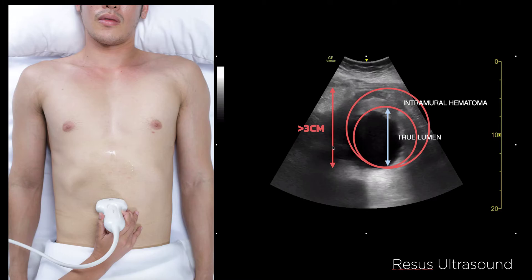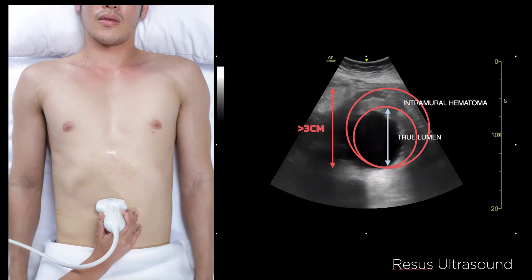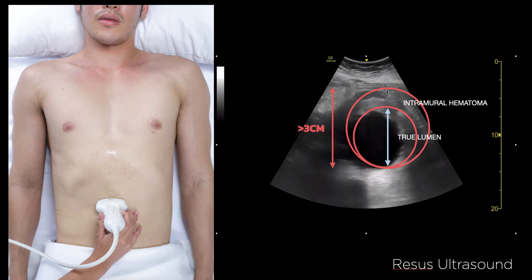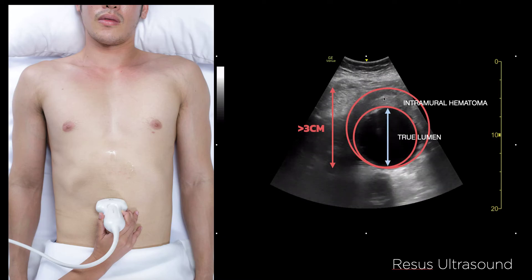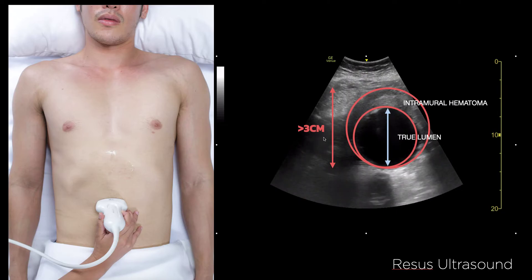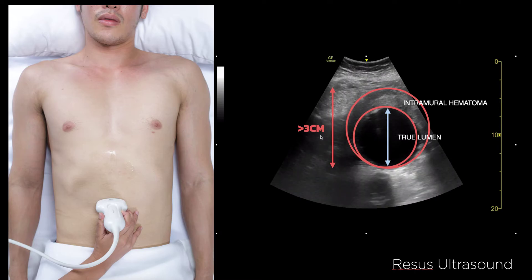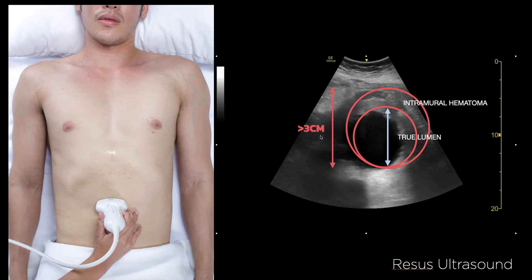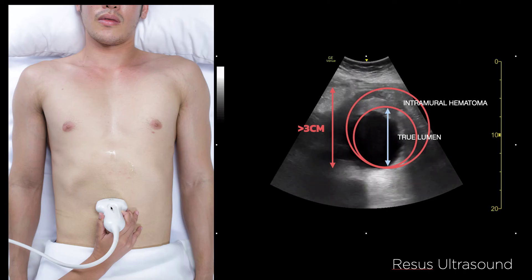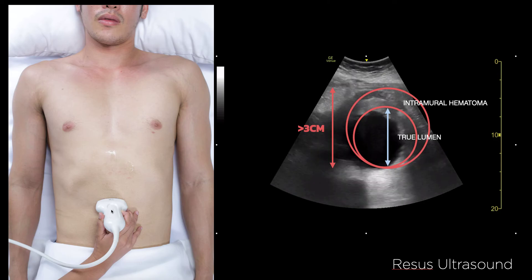Look carefully to see the hematoma and measure from outer wall to outer wall. As you can see here, this measures about five-point-five centimeters. If the diameter is more than three centimeters, it means the patient has Triple-A. If the diameter goes up to five centimeters, the mortality doubles.